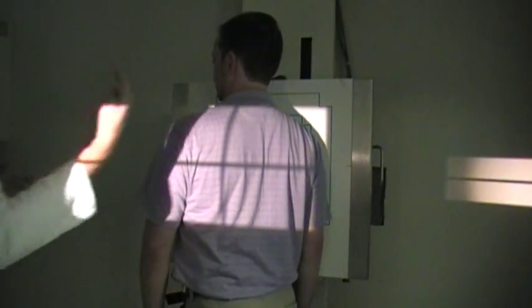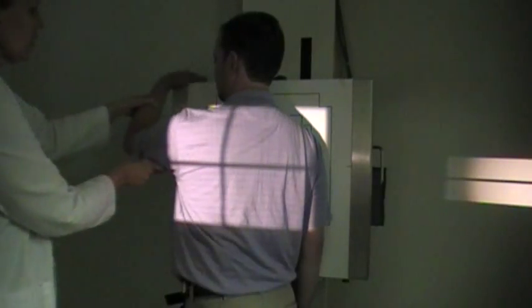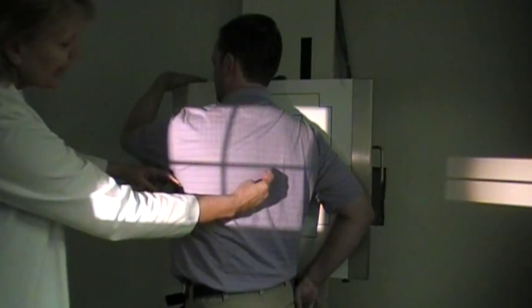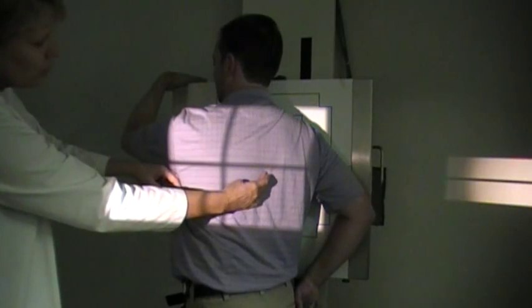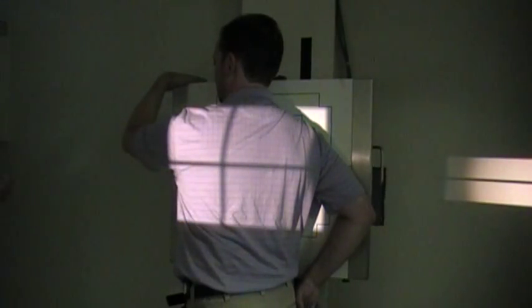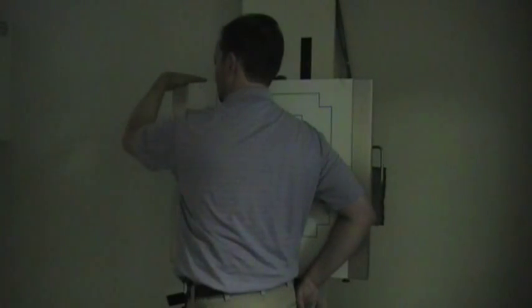So here David is in an RAO. I'm going to bring this arm up, bring this arm out. Okay, and then we're checking our central ray. It's going to be halfway between the spine and the lateral border, and we are including both sides, as you see here. Okay, but this is going to demonstrate that left lung the best.